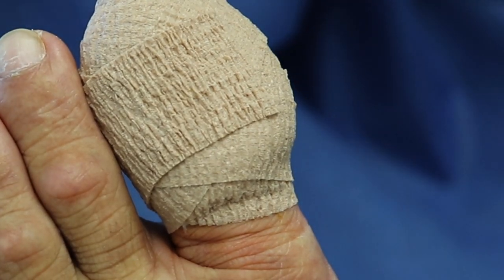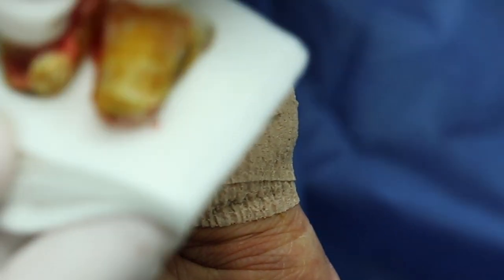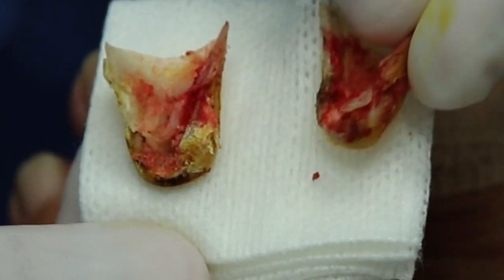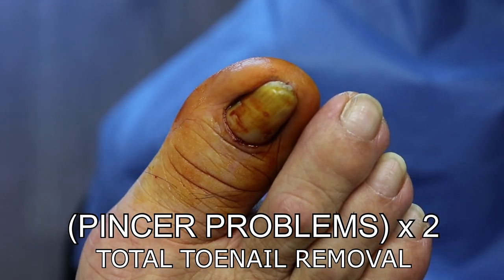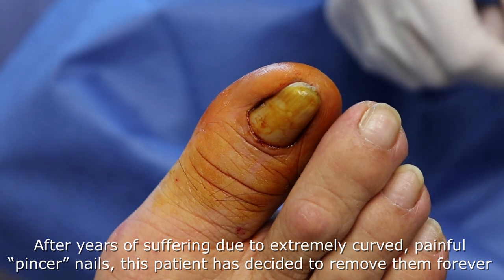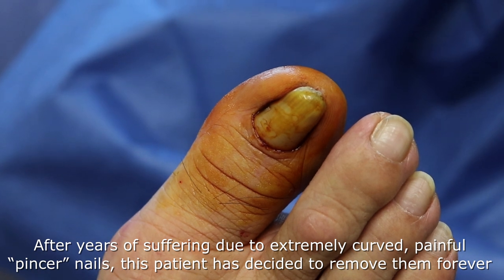I'm going to put you down. Do you want the nails? Can you put it on the... I'm going to put it on something but I want to show the camera. It's like a big tooth. Get the money shot. Let me put on my gown. Let me just wipe down the toes and what we're going to do is we're going to be putting on a tourniquet - this blue rubber band - and this is to stop the bleeding so I can see everything very clearly and so the acid works very well.